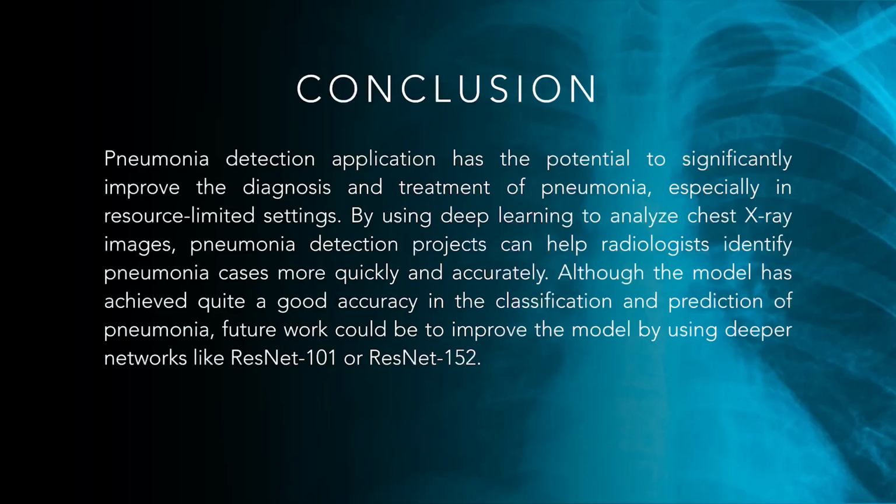In conclusion, the pneumonia detection project utilizing deep learning for the analysis of chest X-ray images represents a transformative advancement in medical diagnosis, particularly in resource-limited settings. This project harnesses the power of convolutional neural networks to automate the identification and classification of pneumonia, thereby augmenting the capabilities of healthcare professionals and enhancing the accuracy and speed of the diagnosis.